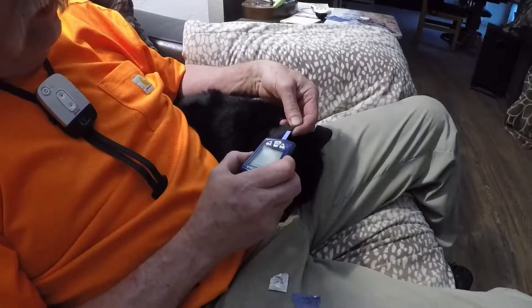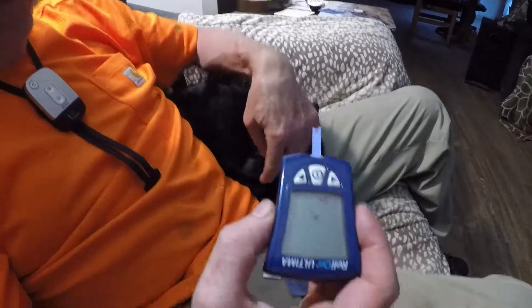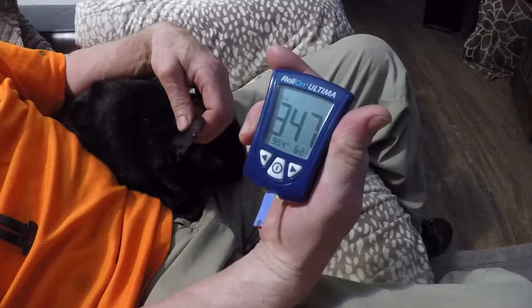Sometimes you just don't get a good spot and you have to click it again. It takes five seconds for it to read. The result is 3.47 — it's a little high this evening.